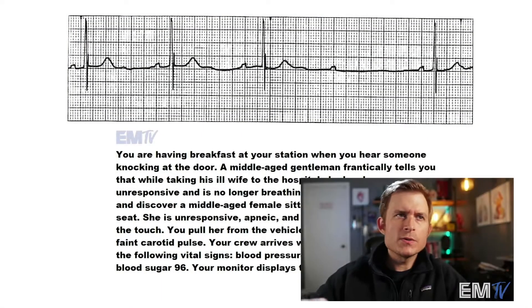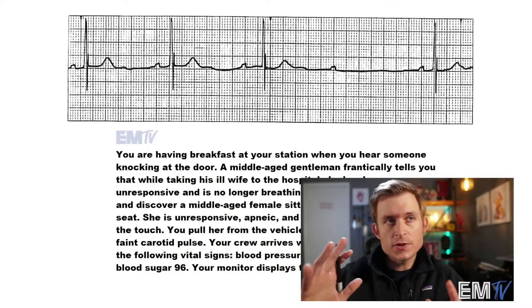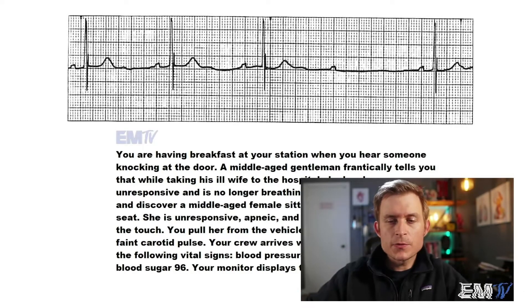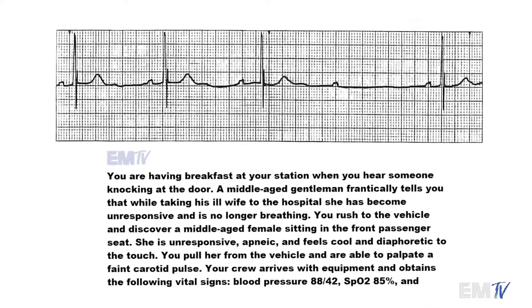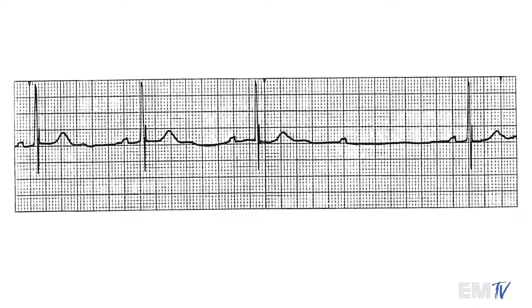This card has definitely been known to throw off my students, so let's take a look at the rhythm first and see if we can make an identification. One of the first things that should jump out at you is the speed — this is going about 40 beats per minute. The next thing you may have noticed right off the bat is the fact that you have this gap here.